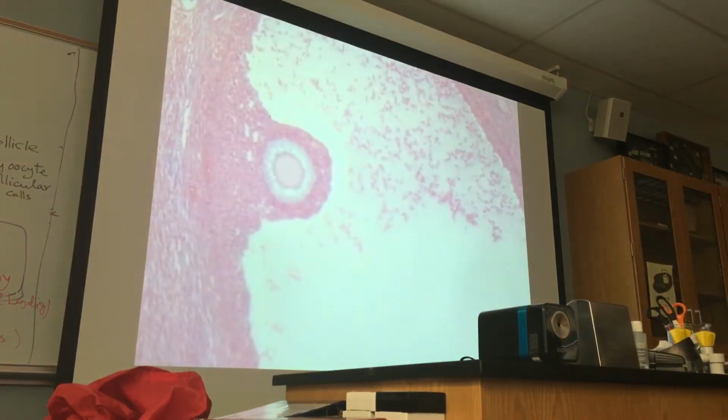There you go. This is not the highest magnification. It can be magnified more. What is the name of this structure? Granulosa cells? Of course these are granular cells, but what is the name of the structure?